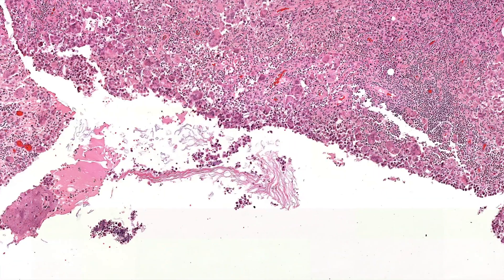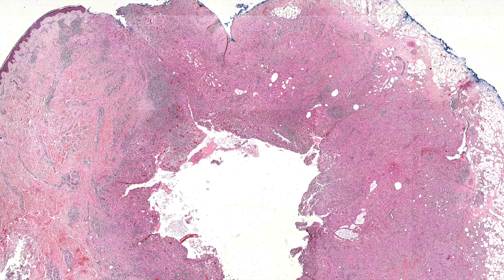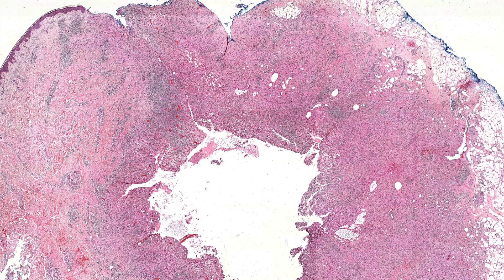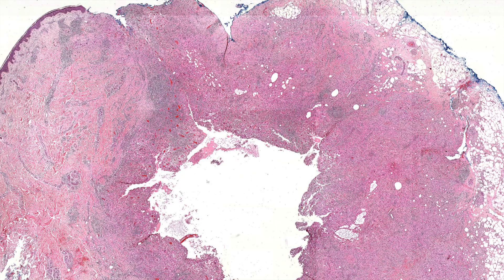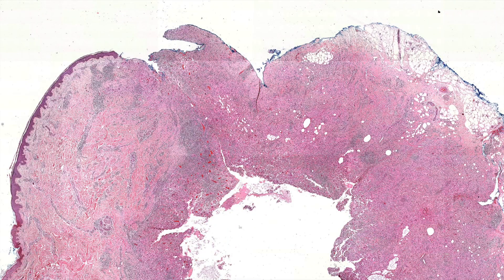There might be one that's kind of a distractor — it looks more like just a ruptured cyst or ruptured folliculitis, and it's pretty huge. Ruptured cyst and ruptured folliculitis are all the same spectrum of microscopic findings, but usually follicles can be smaller and superficial, cysts big and deep. Sometimes I can't tell, but it's the same spectrum of things happening.